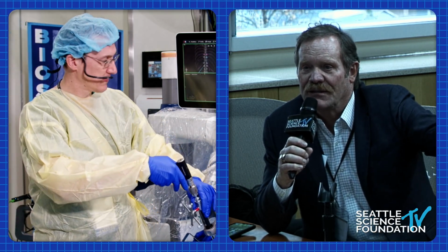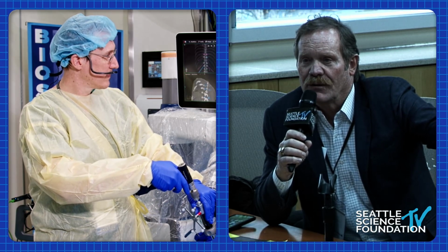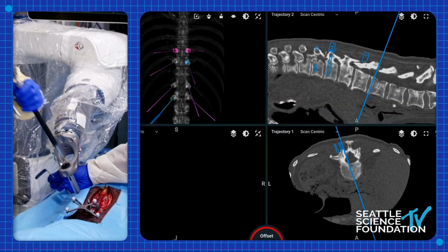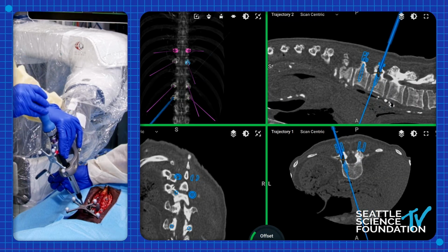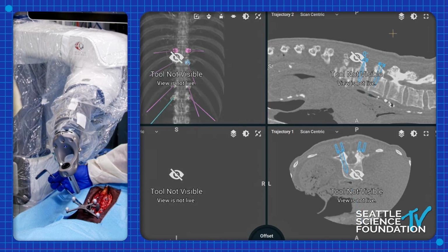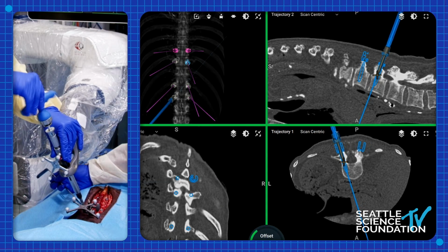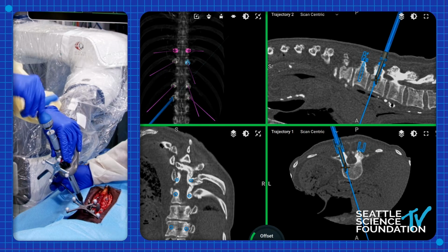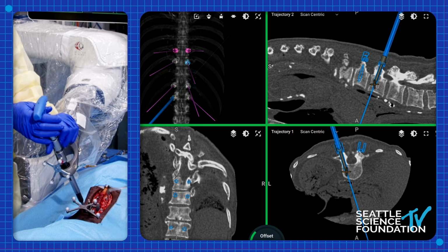I'm acknowledging the value of not just navigation, but I think the robotic, it's a great place for it. I think this changed the trauma world, and there's been so much published about it. I think it's pretty well accepted, and it's great technology, and the robot's a place that it actually makes lots of sense for those particular cases. You've touched on all kinds of other pathologies, but your single level fracture problem is the ideal case.